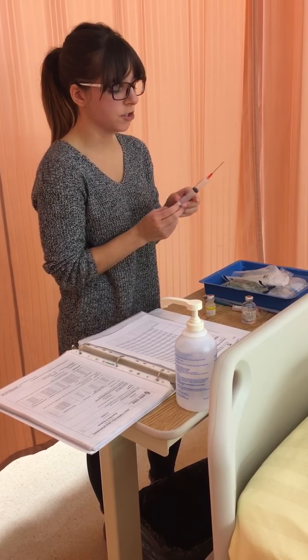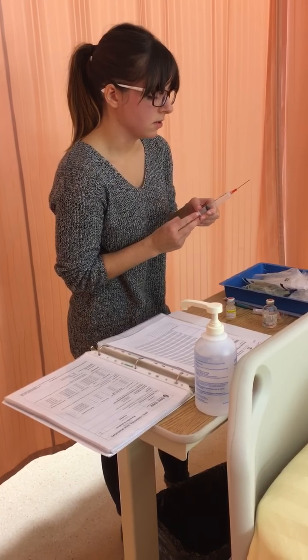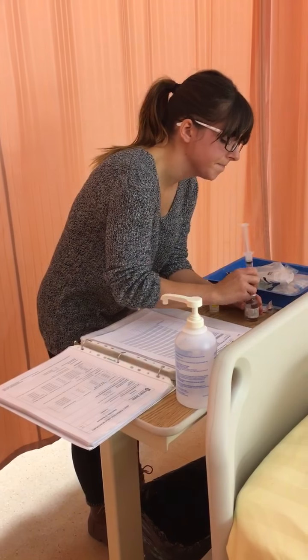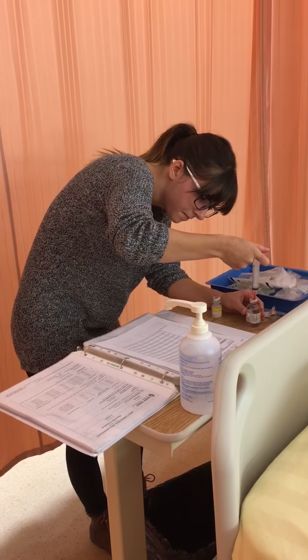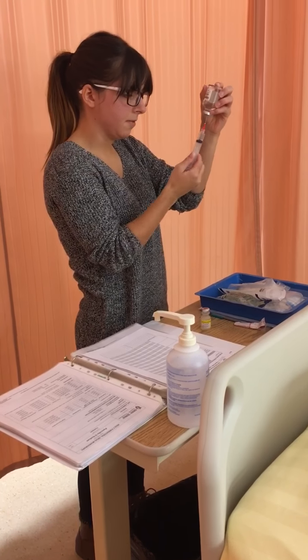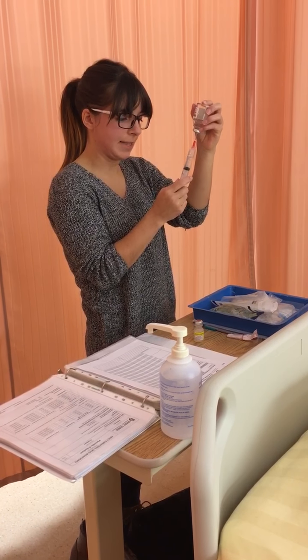That is my final volume after reconstituting. So we're going to inject 10 milliliters of air into the vial, and withdraw 10 milliliters. Again, we're going to make sure that there are no air bubbles.